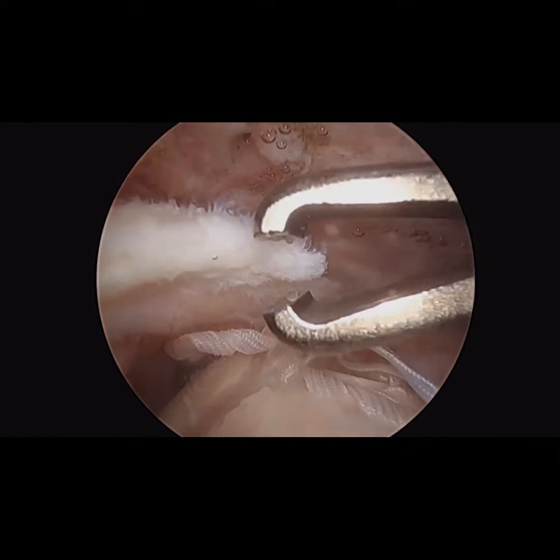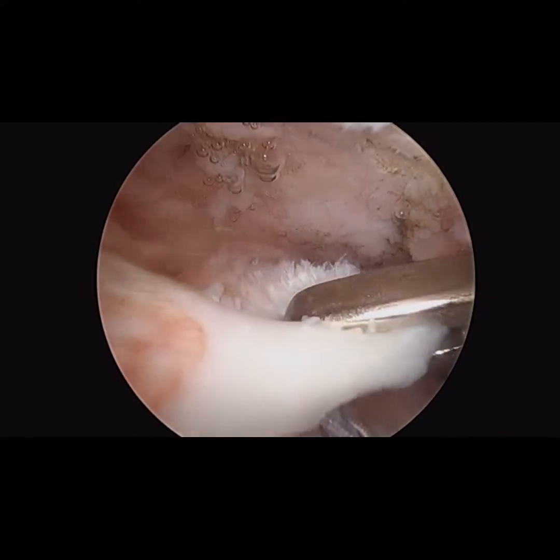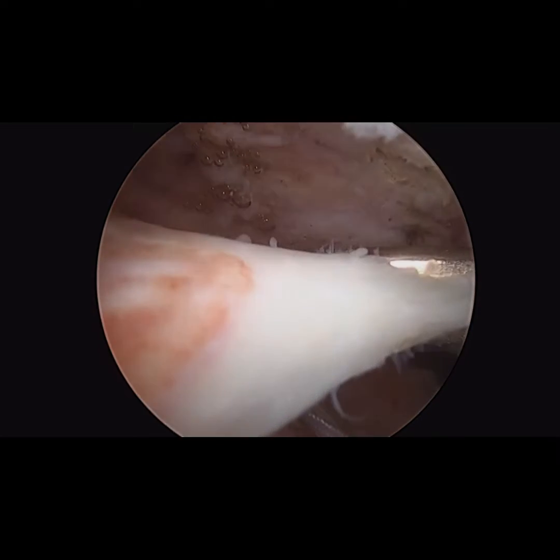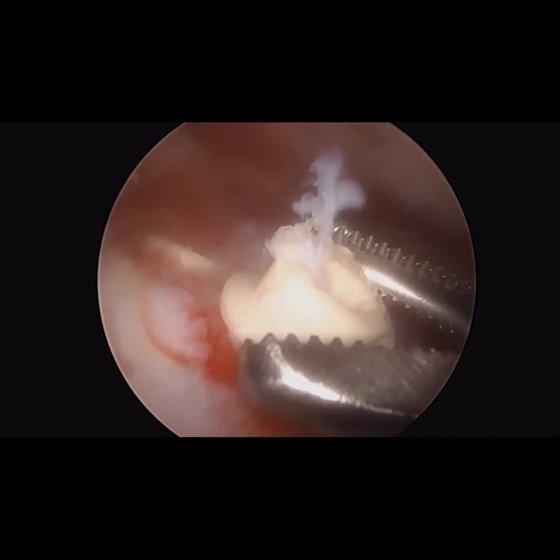The medial anchors were loose. A cuff grasper was then used to mobilize the medial tissue, but it was overall quite atrophied and retracted. I could only mobilize it to the medial aspect of the footprint, and the tissue quality was quite poor.